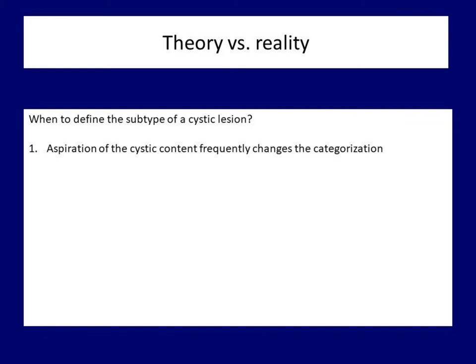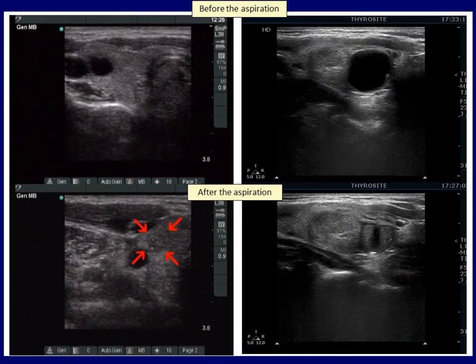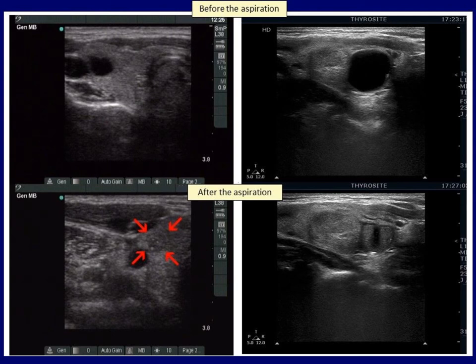Let's see two examples in which categorization changed after aspiration. Both lesions appeared to be pure cysts before aspiration; however, after removal of the fluid, a solid part appeared. Although the left case proved to be a papillary carcinoma, this is an extremely rare finding — the risk of malignancy in a completely or almost completely cystic nodule is almost zero, surely below 1%. In the right case, a solid area appeared after removal of the fluid, explained by the compression of the fluid on the solid part: after releasing this compression, the solid part may appear or become much larger.